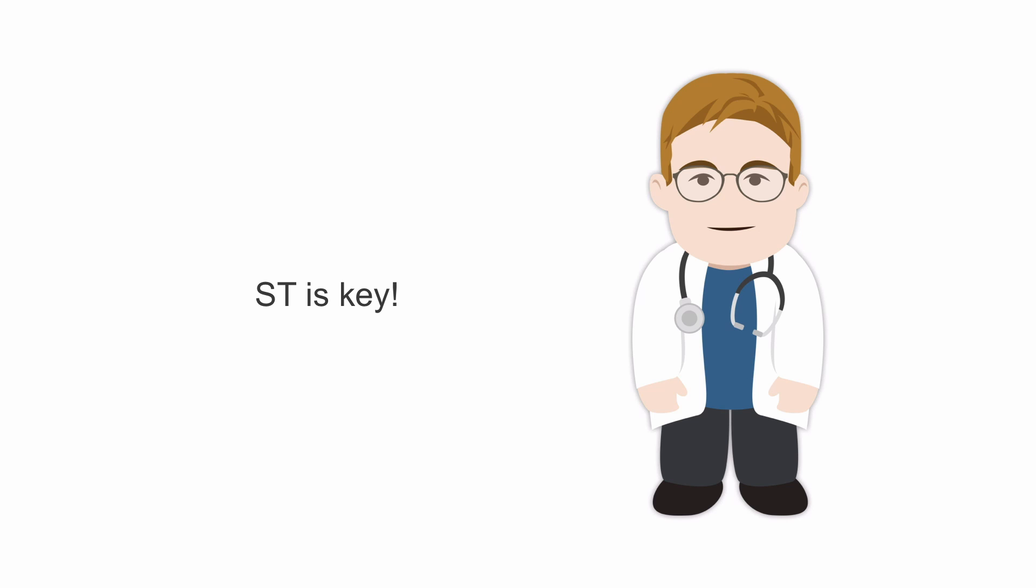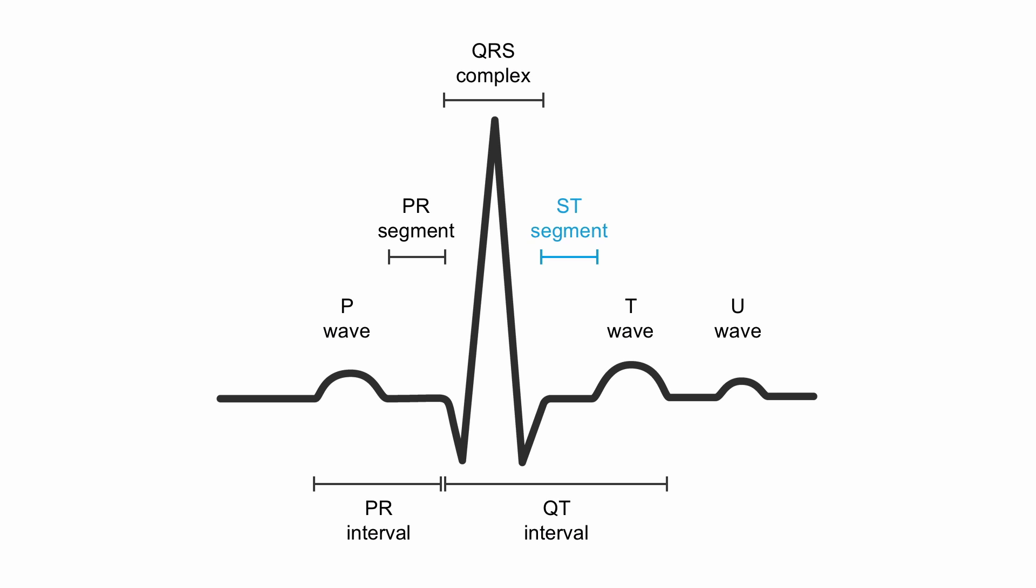We know now that our ST segment is really the key to seeing if there's myocardial ischemia during stress testing. Here we have our ST segment and here we have our baseline, isoelectric when the baseline and the ST segment are on the same level.